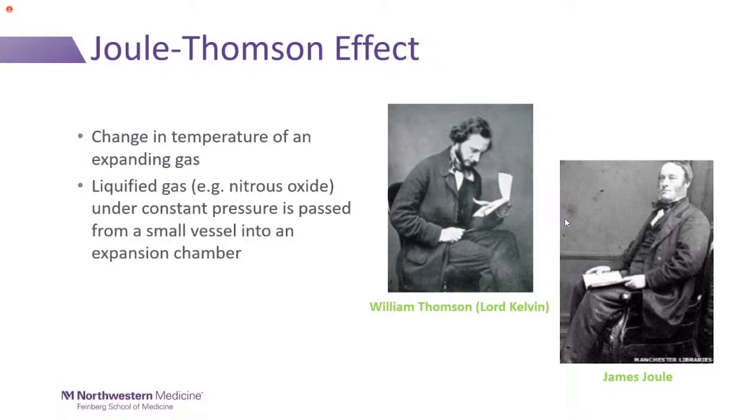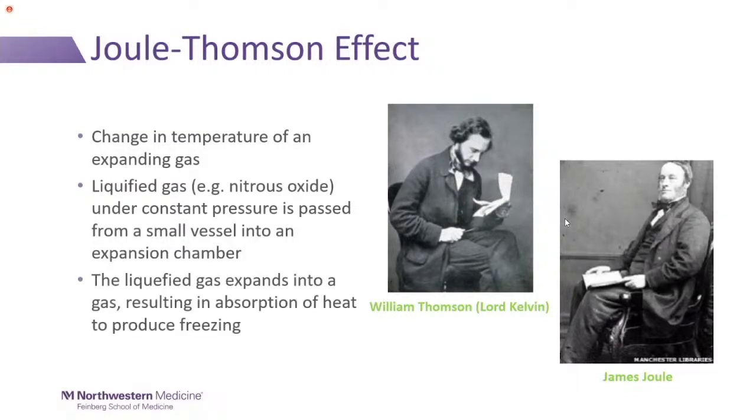So how does that work? Liquefied gas, how many people do cryoballoon ablation? Almost everyone, okay. Have you felt the tube delivering the gas when you're doing cryoablation? It's really cold, and it's cold for a reason. It's delivering this liquefied gas, nitrous oxide, under constant pressure, and it's passed from a small chamber into an expansion chamber. And that liquefied gas, as it expands, actually absorbs heat. So it's removing heat, and that's ultimately what causes the freezing.